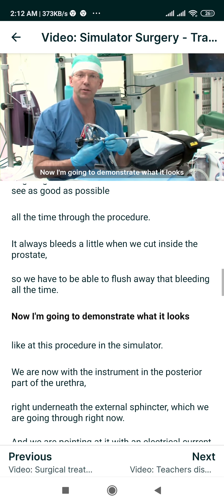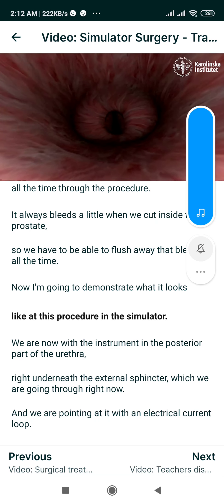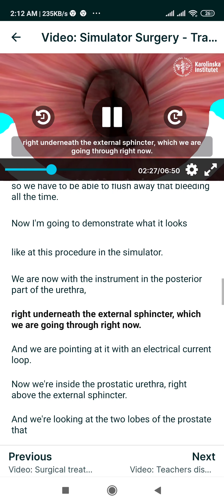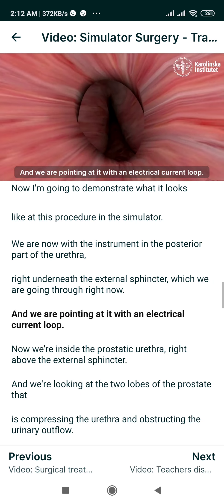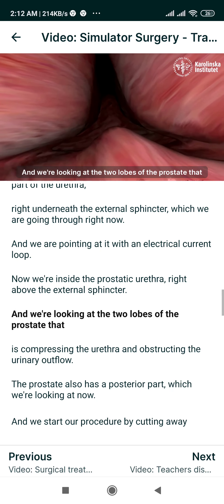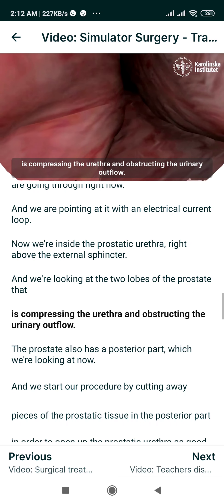Now I am going to demonstrate what it looks like during this procedure in the simulator. We are now with the instrument in the posterior part of the urethra right underneath the external sphincter, which we are going through right now, and we are pointing at it with the electrical current loop. Now we are inside the prostatic urethra right above the external sphincter and we are looking at the two lobes of the prostate that are compressing the urethra and obstructing the urinary outflow.